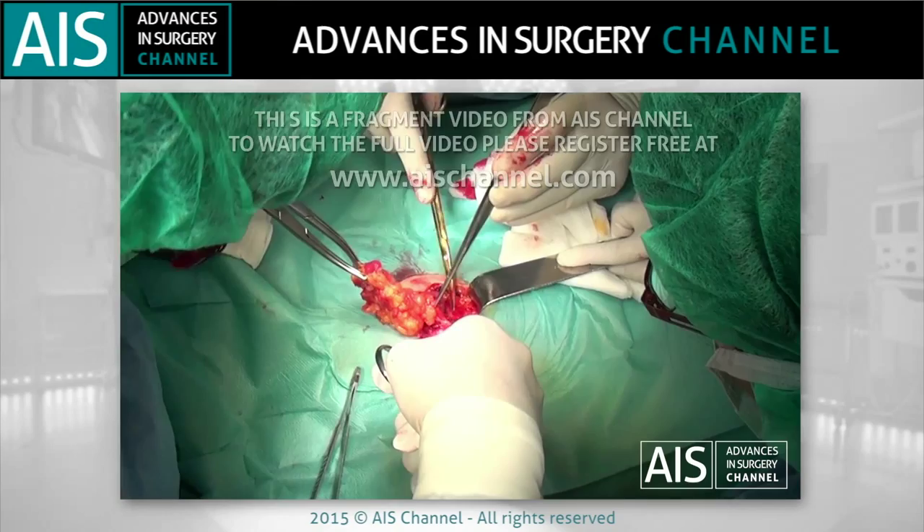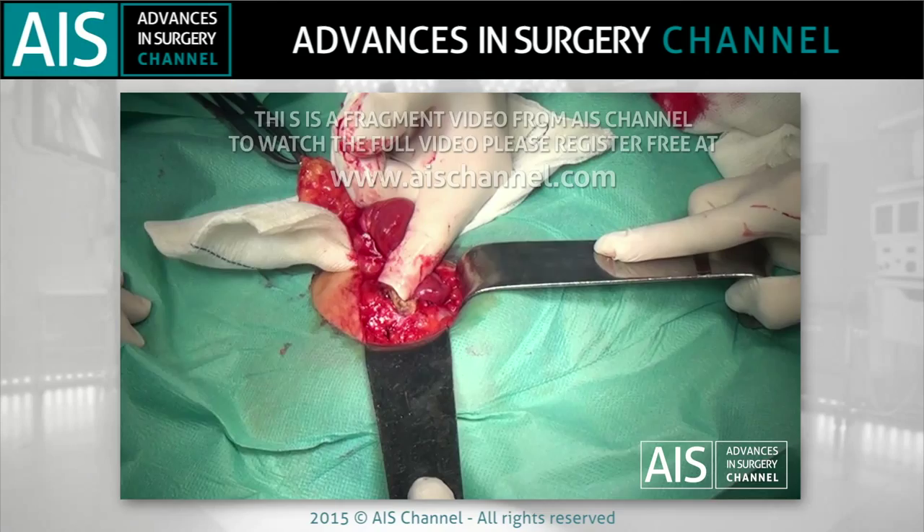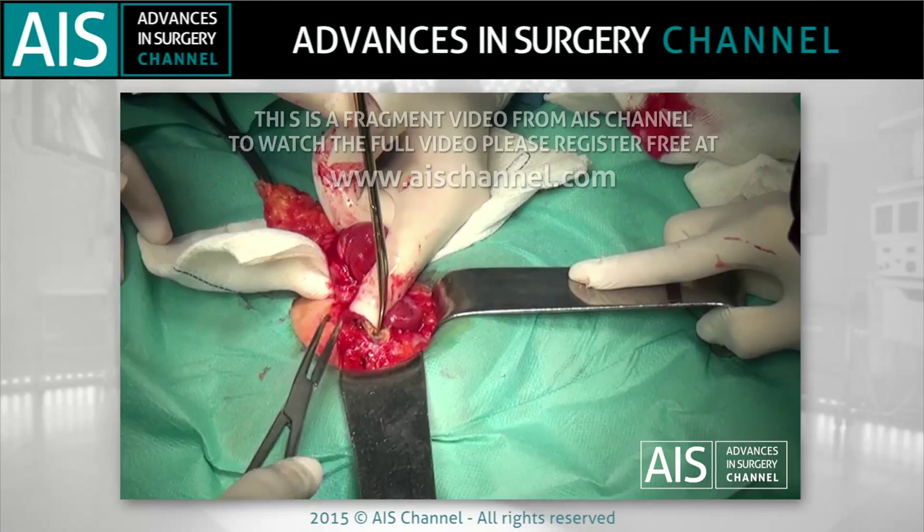The first step is to take down the ileostomy, dissecting from the skin to the muscular fascia. A fasciotomy is performed in order to allow the introduction of the pouch into the abdominal cavity.